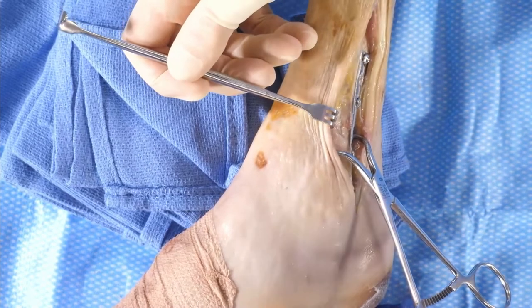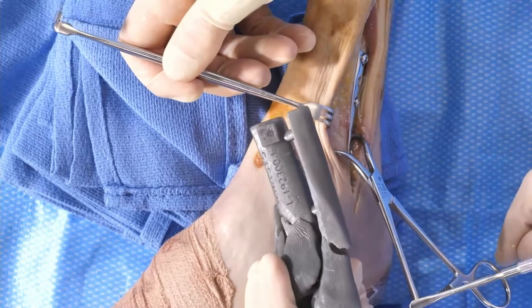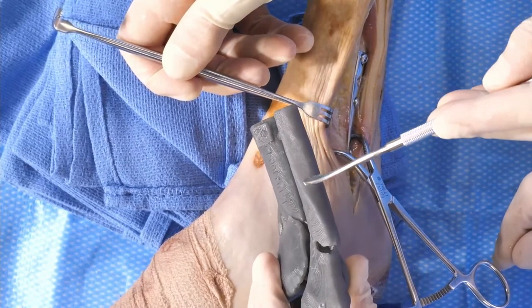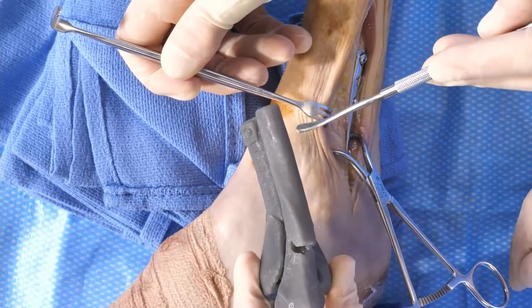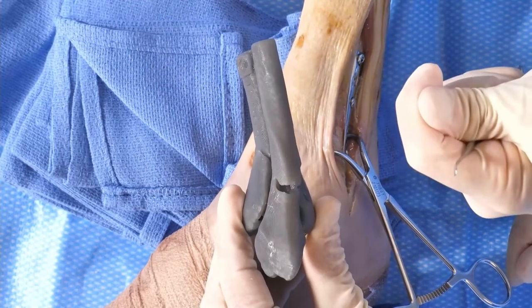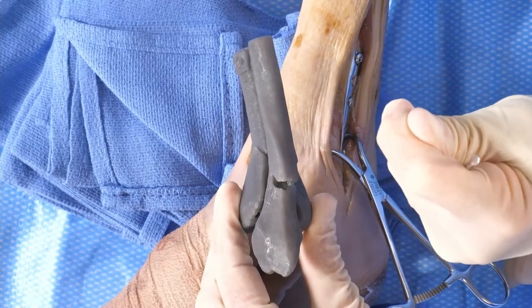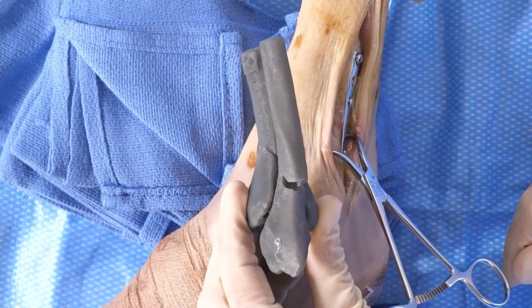So just seeing a million fibula fractures, you can kind of get a sense of where this ridge is. Here, distally, it's posterior, and then it starts to come up, and it comes more anterior as you come proximal. And that's really where you want your posterolateral plate to sit. So the twist is almost always to keep the plate posterior distal and have it come anterior proximal a little bit, and you give it a little bit of bend at the same time, and it'll contour it almost perfectly.